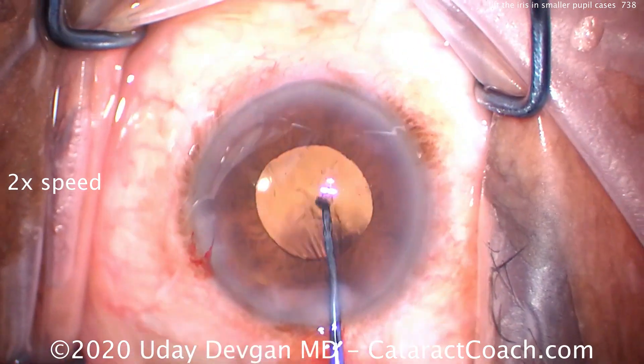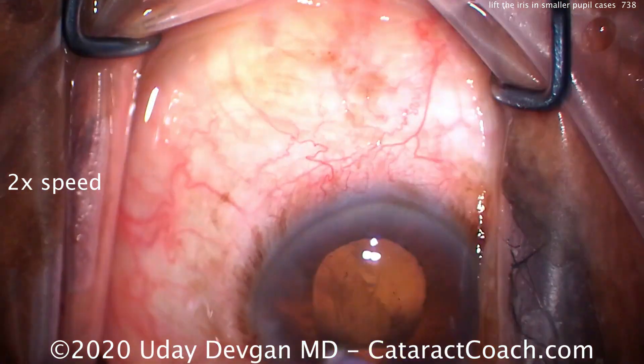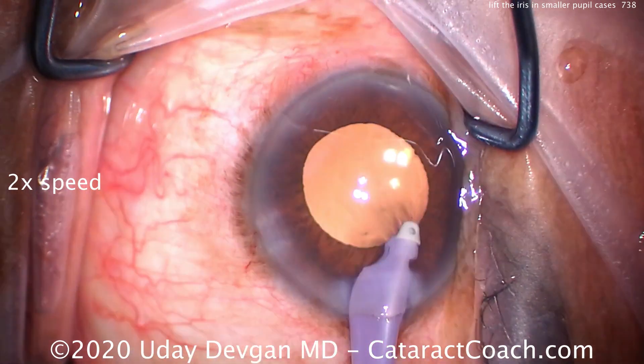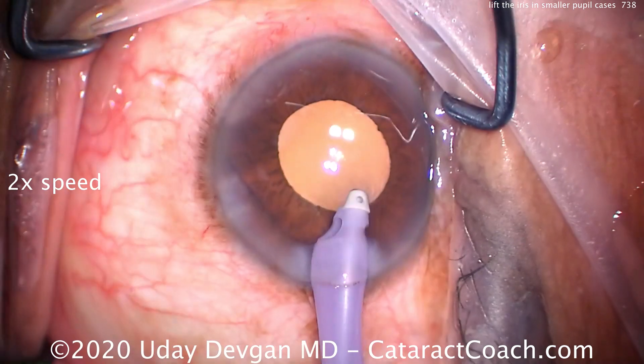Underneath that we check the rhexis 360 degrees, as well as make sure there's no residual lens material. Now we can go inside the eye and confidently remove the viscoelastic, knowing that there is no cortex or other lens material that's going to become apparent on post-op day one or thereafter.